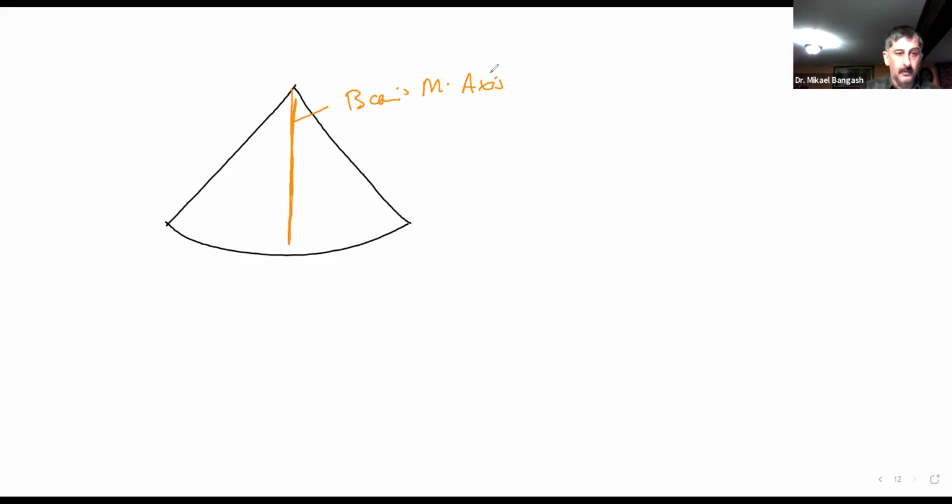Okay, so what would a good lateral resolution be in this case here? That structures that appear here in the beam's main axis were physically only present in this area here, right?